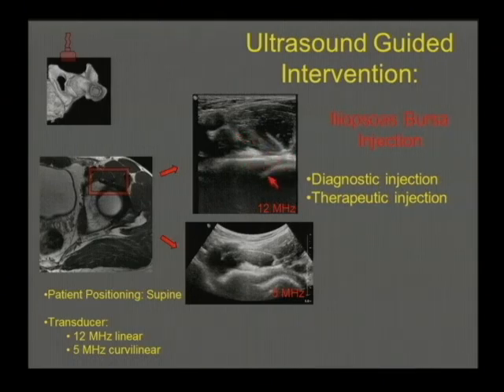In other cases, there's really no detectable fluid at all in the iliopsoas bursa, and that doesn't mean that they're not having symptoms coming from that location. The way we set up for the procedure here is a little bit different.